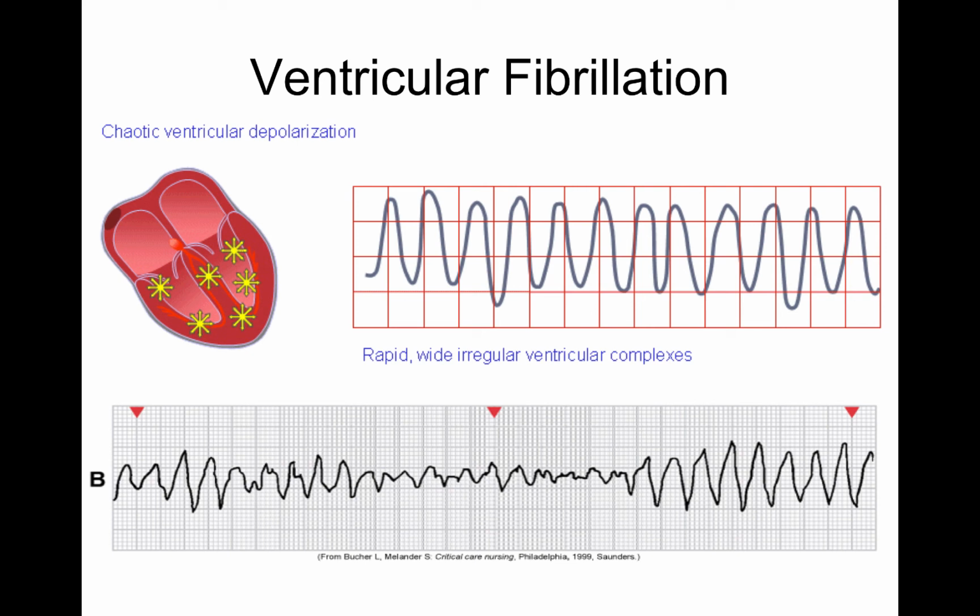Everyone is pretty much CPR certified, so when you are shocking someone with an AED and it says shock advised, one thing that you're looking for now after going through this lecture is to identify that when the AED is going to shock the person, it is going to be because ventricular fibrillation is present.